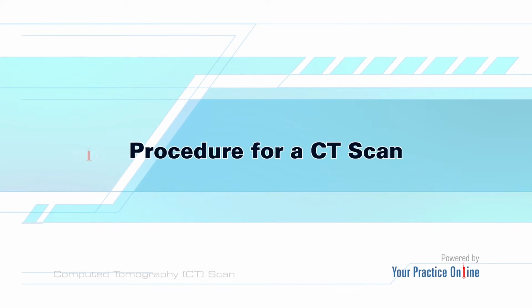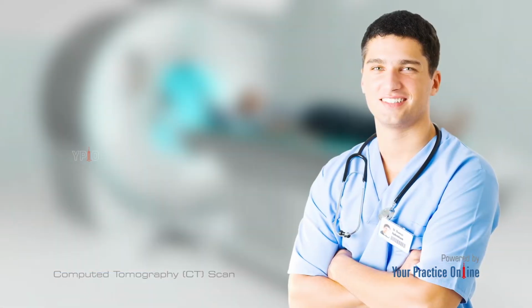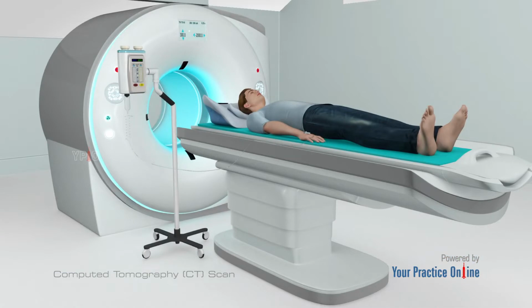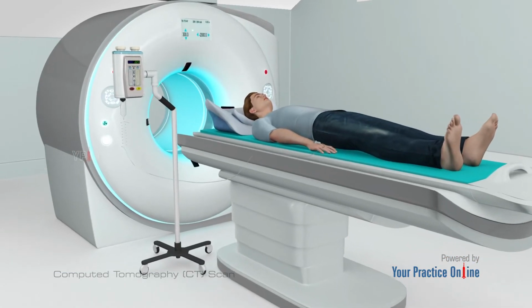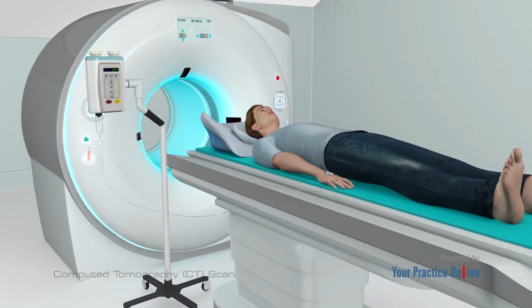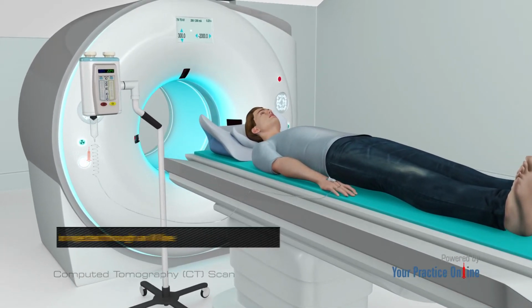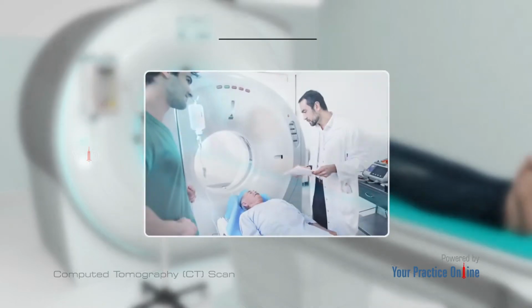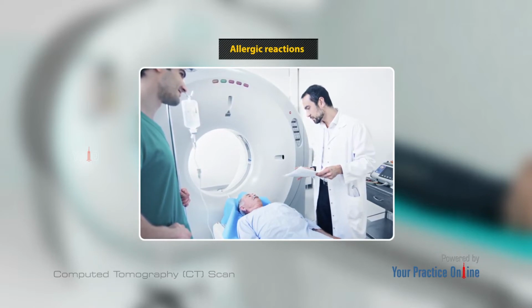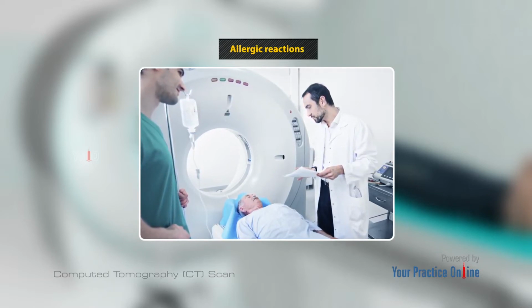Procedure for a CT scan. A CT scan is performed as an outpatient procedure and involves the following steps. You are asked to lie on the procedure table connected to the CT scanner. Contrast dye, if needed, may be given to you orally or injected through an IV line connected to your arm. Suitable care is provided if you develop any allergic reactions related to the dye, such as sneezing or itching.